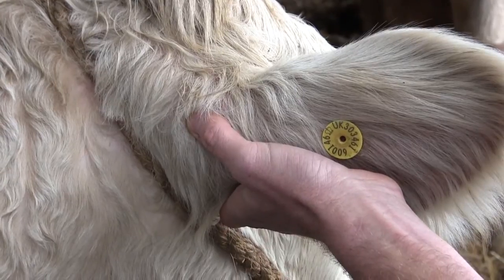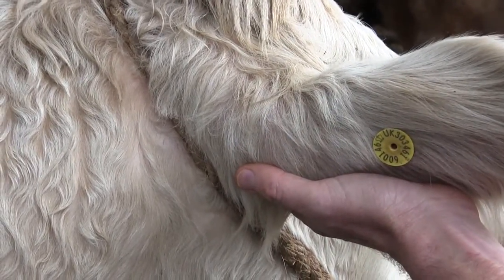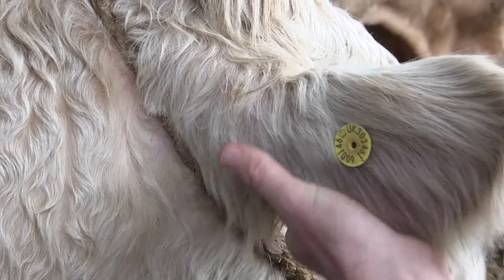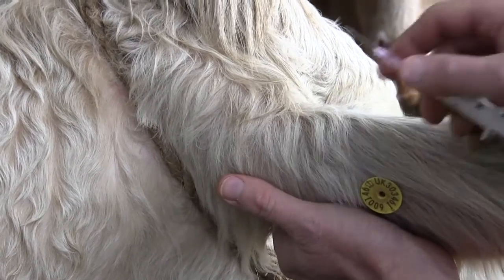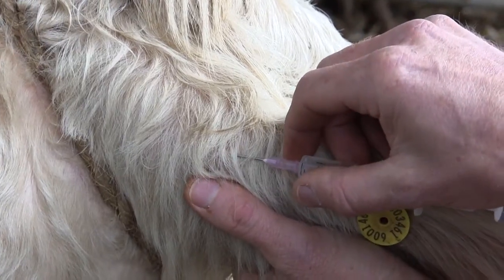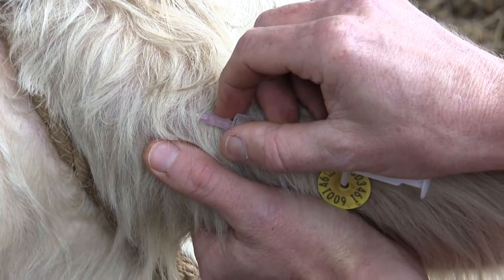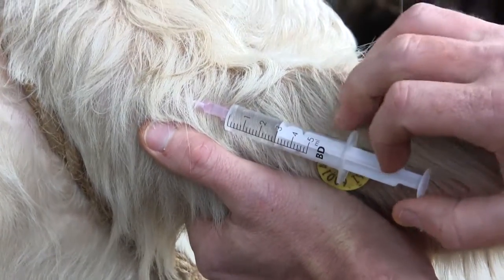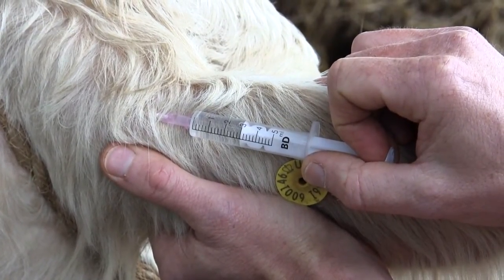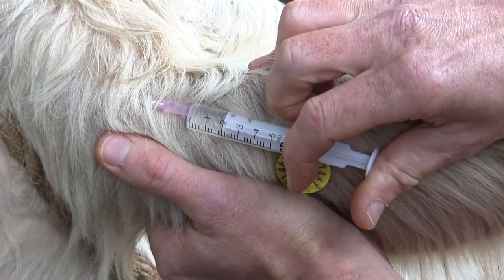Once you've determined where your injection site is going to be, the ear is grasped. You look for a clean uncontaminated area of skin and prepare to insert the needle. The needle is inserted under the skin and then advanced up to the hub, taking care to avoid any blood vessels or nerves in the area. Once the needle is inserted up to the hub, aspirate the plunger to make sure that you aren't in a blood vessel, then inject the solution.